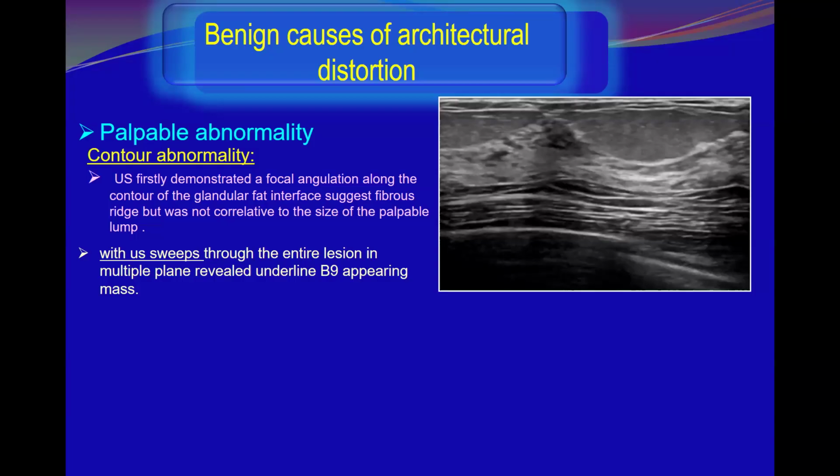What I had felt under my finger was not corresponding to this small pointing tissue.